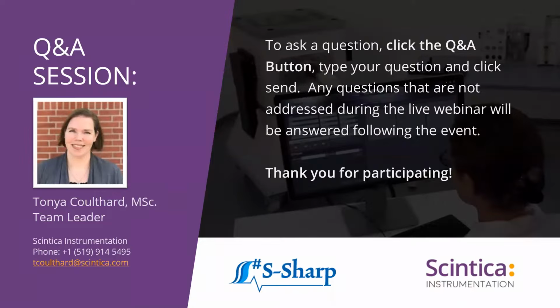Great. Okay. What's the maximum frame rate in B mode? Yep, so this often will come up with cardiac researchers, and I was surprised it wasn't one of the first questions that I scrolled through. The frame rate with a single element transducer is 30 frames per second for normal B mode imaging. The system does have a specific cardiac reconstruction mode, which is possible, and that's basically where the system is going to open it up, take as many 2-dimensional B mode images as it can, acquired with that ECG signal, and it can then reconstruct those images back into a cine loop of the entire cardiac cycle, and that would be at 190 frames per second. So that's going to give you a very nice frame rate for looking at cardiac function.